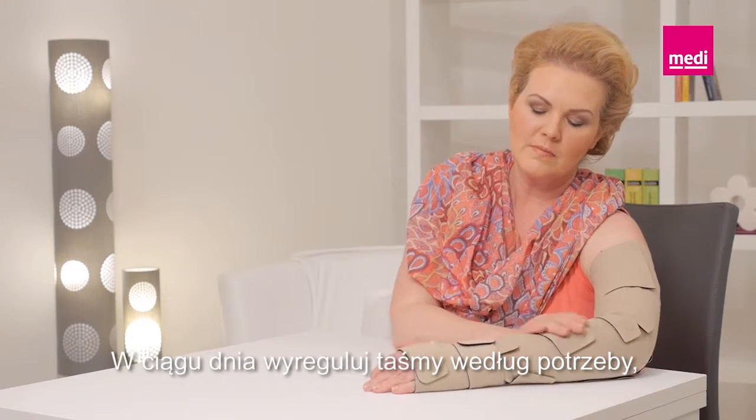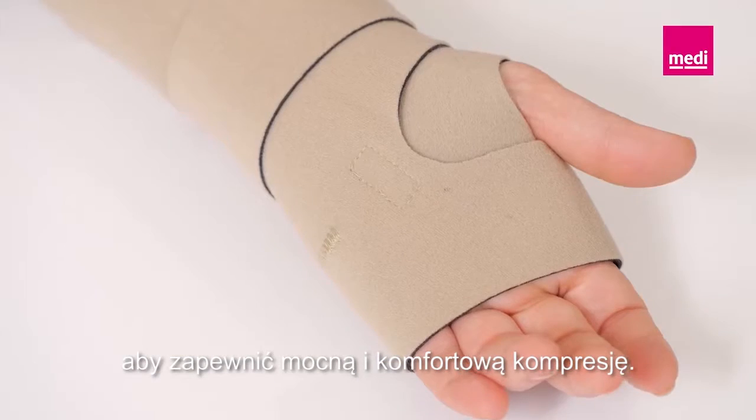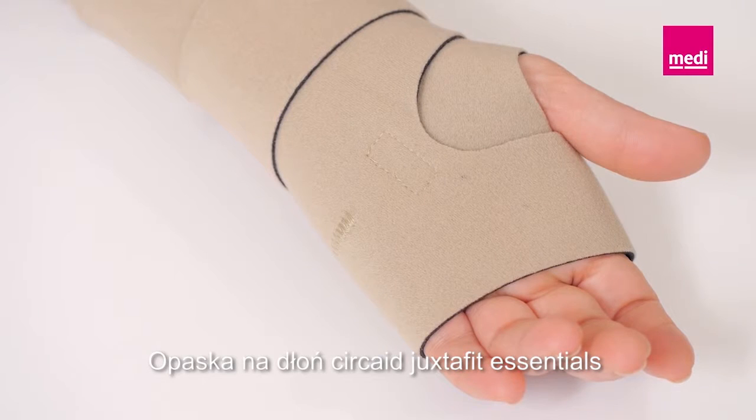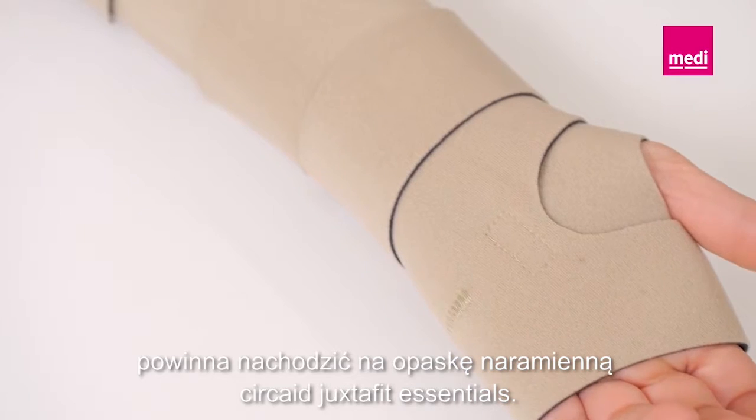Readjust the bands as necessary throughout the day to maintain a firm and comfortable level of compression. The Circade Juxtafit Essentials hand wrap should overlap with the Circade Juxtafit Essentials arm.